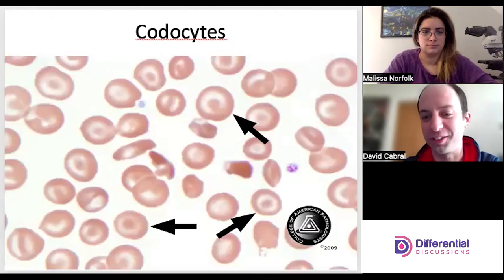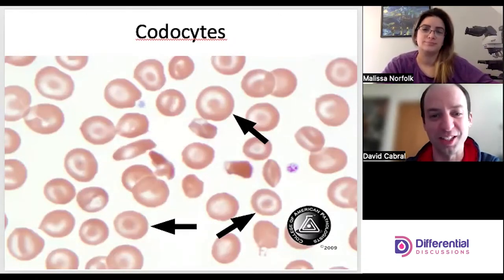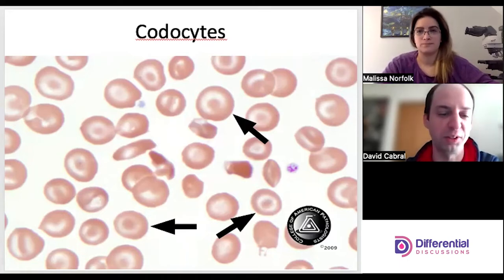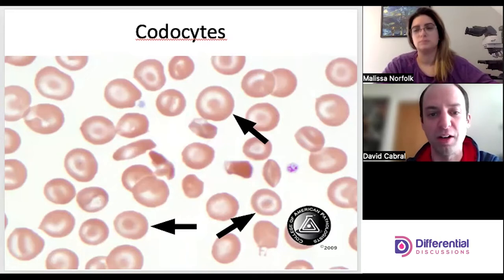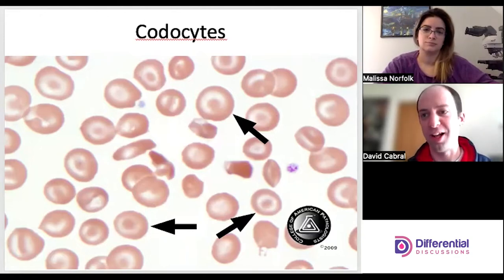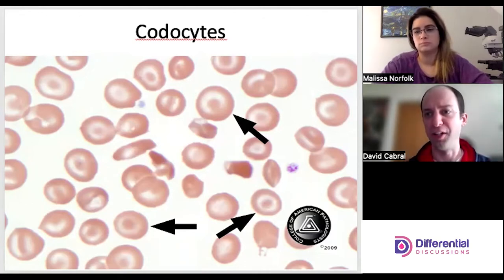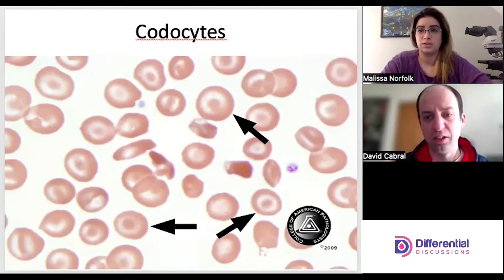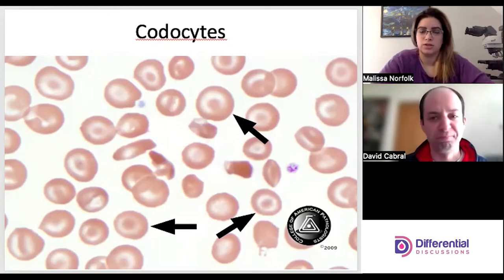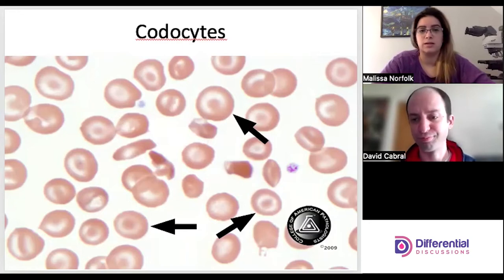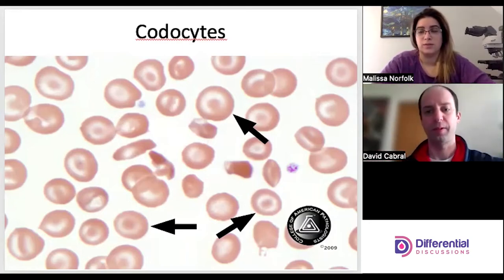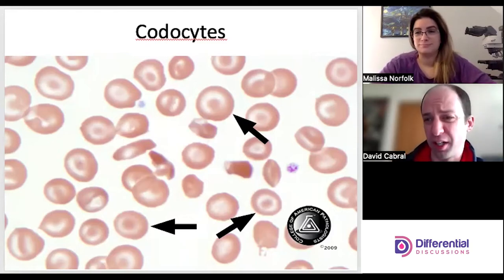Codocytes, also known as target cells — med techs and med lab scientists probably reference them as target cells most often. Generally you have less hemoglobin inside the cell, giving this incomplete fill visual picture — it looks like a target. They're associated with hemoglobinopathies like sickle cell, hemoglobin SC, and thalassemias.